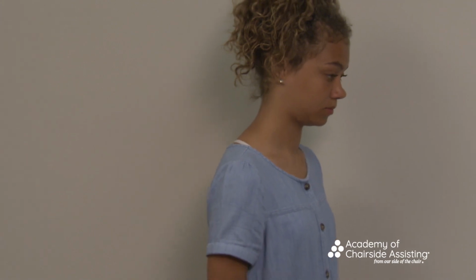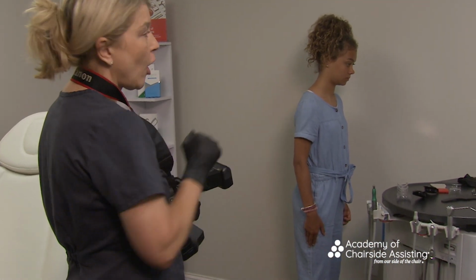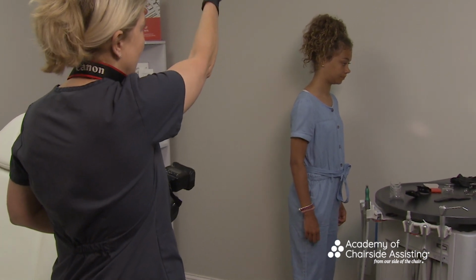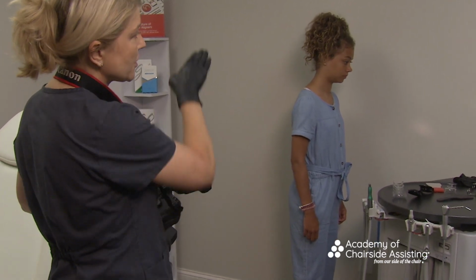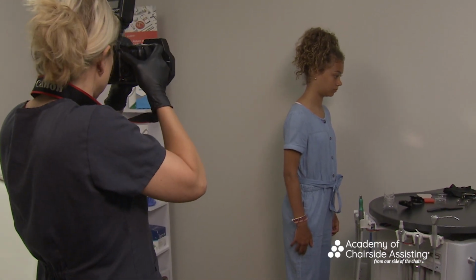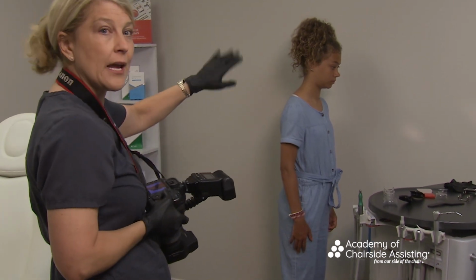So now what we want to do is we have all of our patients turn to the left, right? And this is going to be our profile shot. What I want to do is I really want to make sure that my line and my grid comes right down in her ear. That's my focal point. Notice a lot of times when we turn, patients will start to take their head and tip it down. So Kylie, if I was going to take the photo here, her head would be down. The other thing is notice her hair is over the ear.